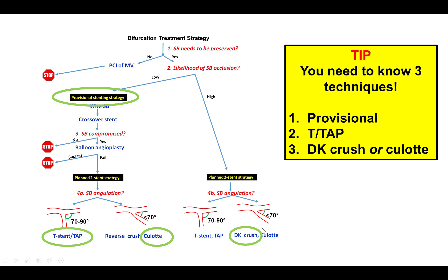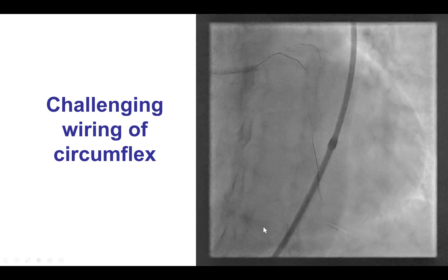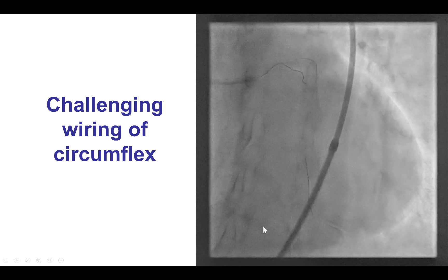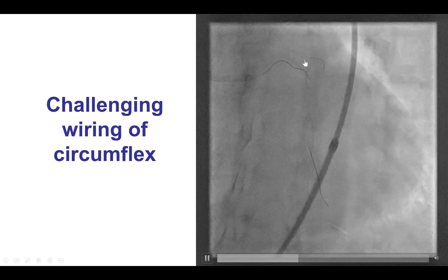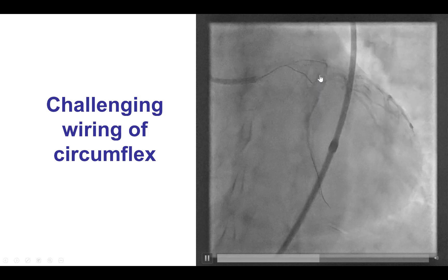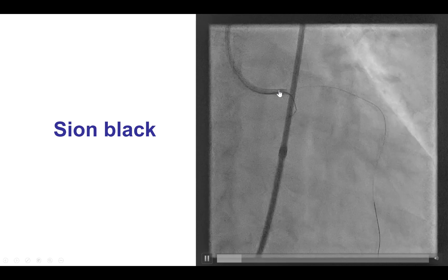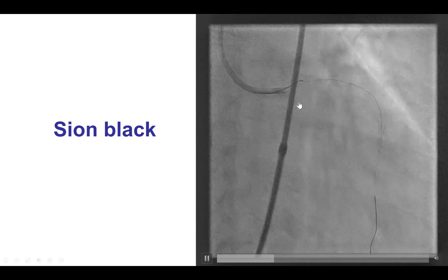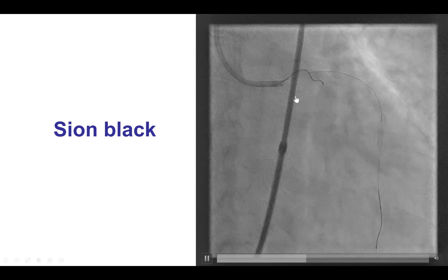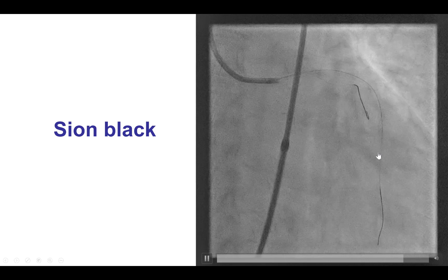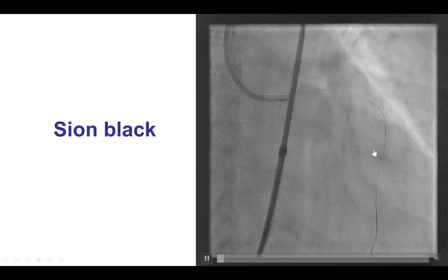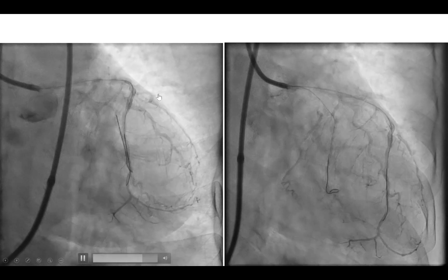The technique we use in our lab for such cases is most often the DK crush technique. For any bifurcation technique, the first step is to wire both vessels. The LAD was quite easy to wire with a workhorse wire, but the circumflex was challenging and the workhorse wire was not successful. One option would be to use a microcatheter to help support the guide wire; another option is to use a polymer-jacketed wire. A Sion Black successfully navigated through the tortuous circumflex, formed a loop, and advanced to the distal vessel without selecting any side branches. Both vessels are now wired.